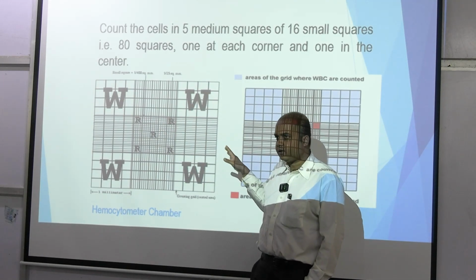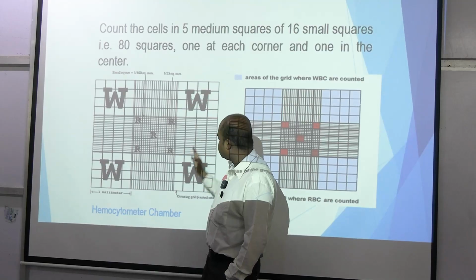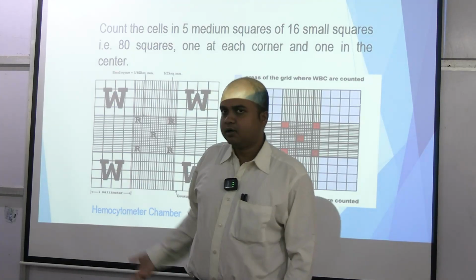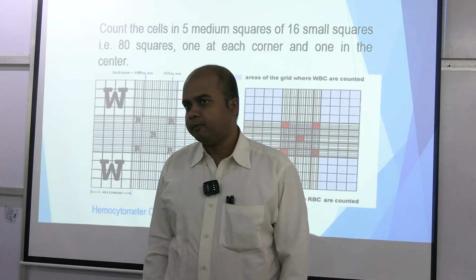You may do it in any direction, but conventionally it is done clockwise. From the left upper you move to the right upper. You will cross this square and then reach it. Then after the 4 are completed, in the case of WBC there is no more complication, the 4 squares are completed. Okay. So that 50x will be the last figure.